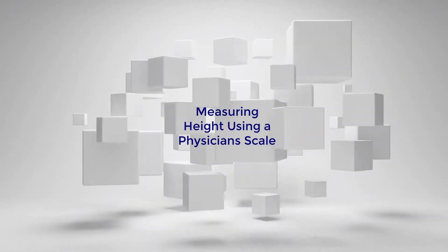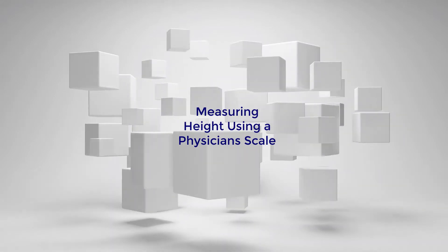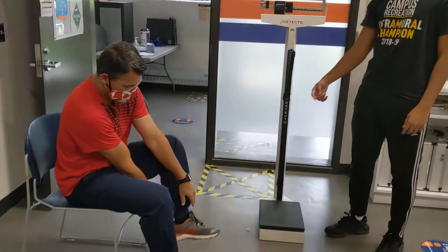This video is on measuring height using a physician's scale. First, have the participant remove his shoes in order to not increase their height.